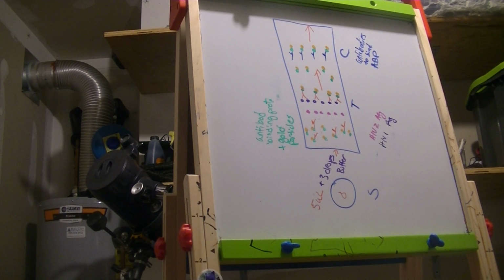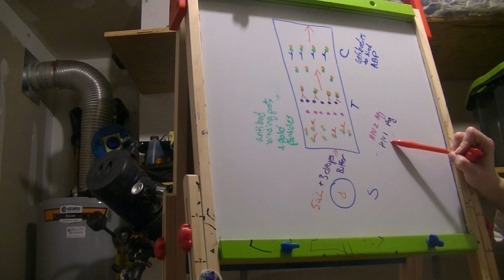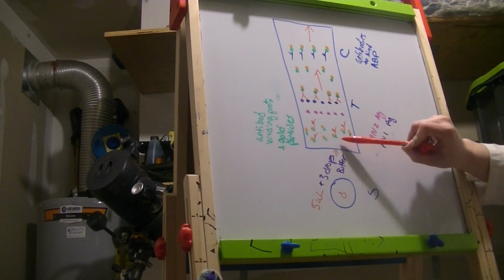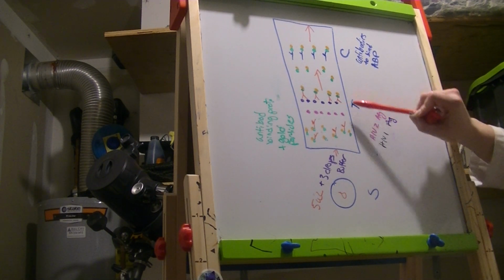So in this example, I have decided to assume that my patient has HIV-1 antibodies in their blood. So these antibodies are traveling through the system. Antibody binding proteins attach to those antibodies when they find and come into contact with them, and the sample continues to travel into the test area.